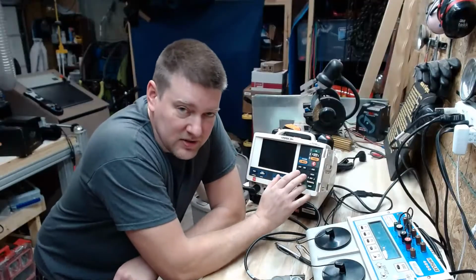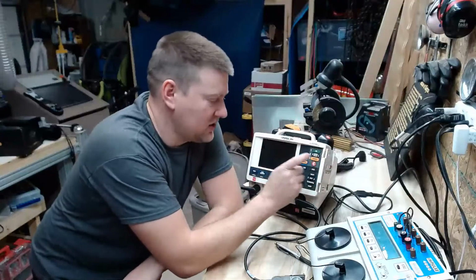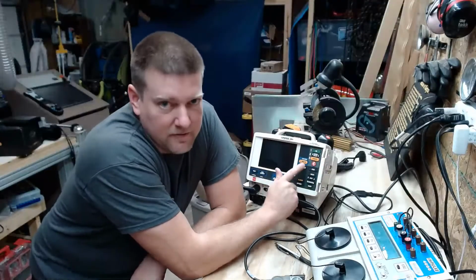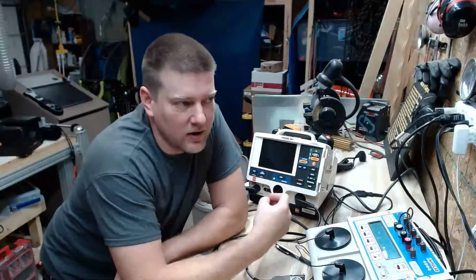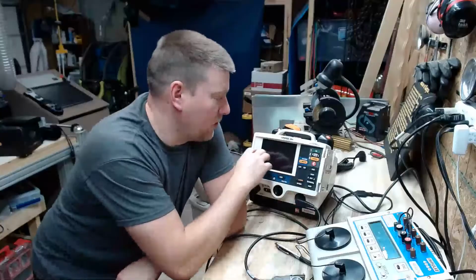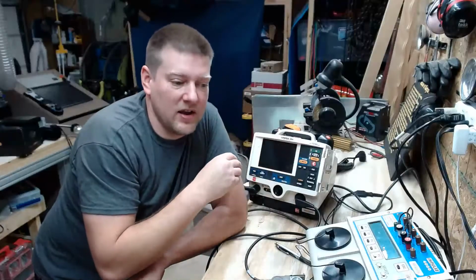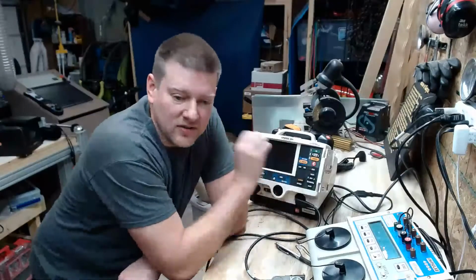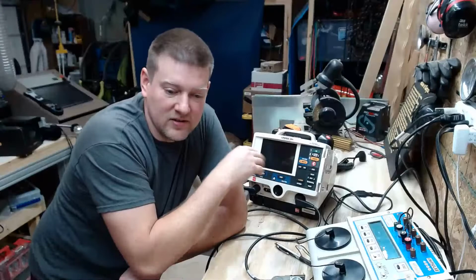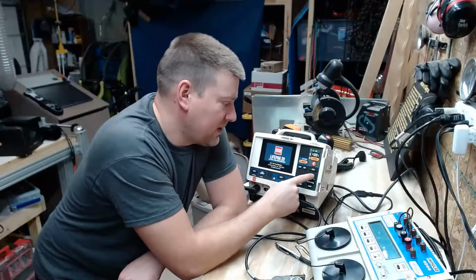The next most important check that we do after cardio sync and after our energy discharges is to test the pacer function. The pacer sends out a pulse to the heart and it tells it when to beat. So when the heart cannot establish its own cardio rhythm, or let's say it can't keep a steady heart rate, then you can use the pacer function to tell it how to beat at a consistent interval. So let's go ahead and turn it on. I'm going to press the pacer button.